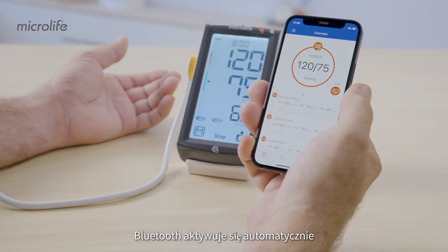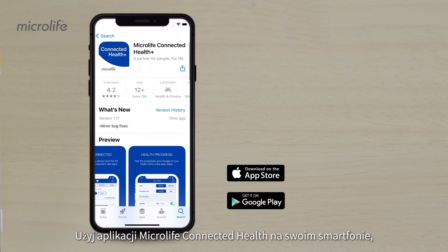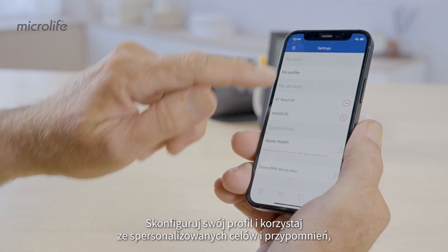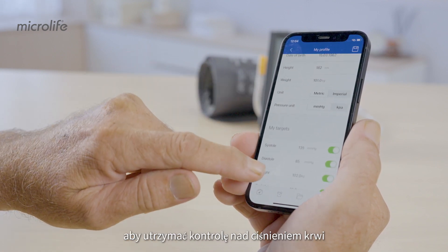Bluetooth activates automatically after a measurement for data transfer. Use the Microlife Connected Health Plus app on your smartphone to store, review, and manage your data. Set up your profile and use personalized targets and reminders to help you stay on top of your blood pressure.